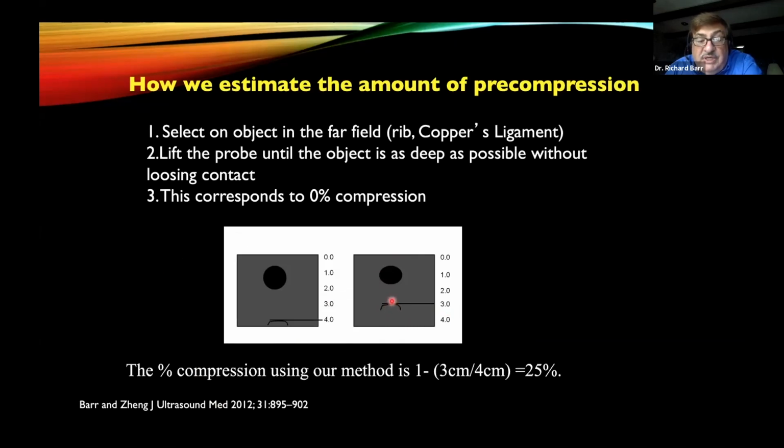So now I'm going to lift up the probe, just lightly lift up the probe. As I do that, we're going to release that tension and the rib is going to fall to 4 centimeters. If I remove any more pressure, I would lose contact. So I have a very light contact. This is also a very good place to do your color Doppler or power Doppler or MFI, because as you compress, you're compressing the blood vessels also, and you'll get much better color if you use this technique. Then you're doing your color Doppler and elastography here, doing your B mode imaging here.